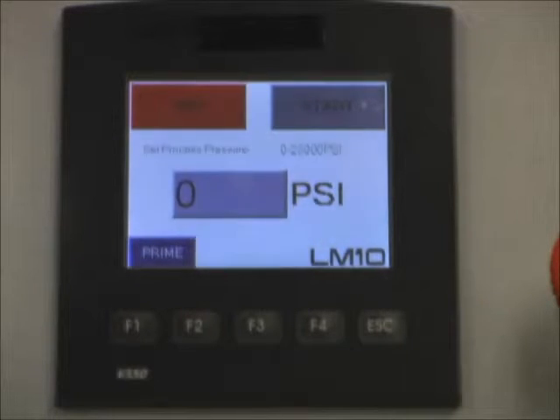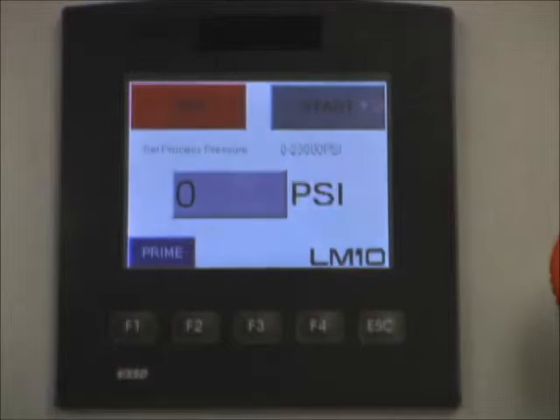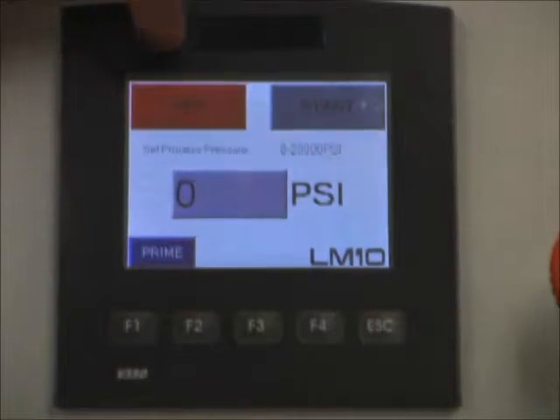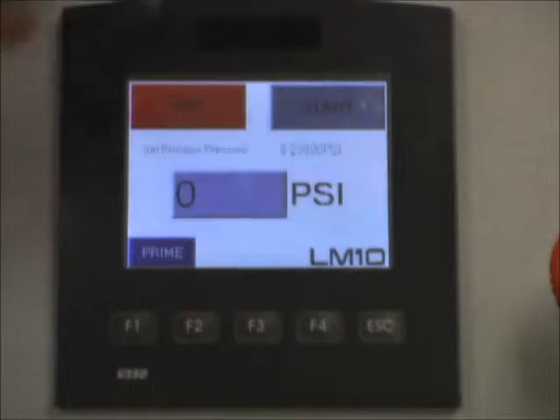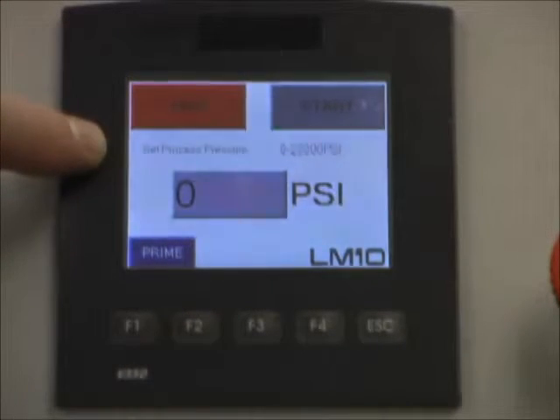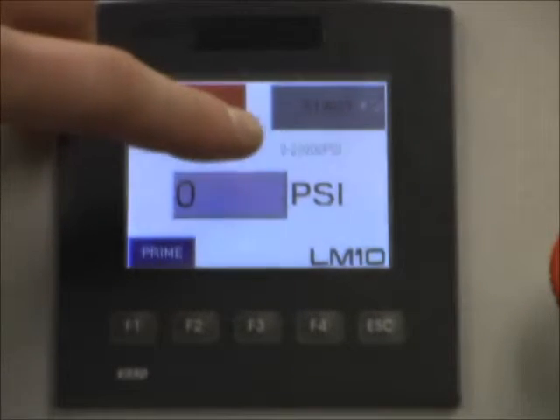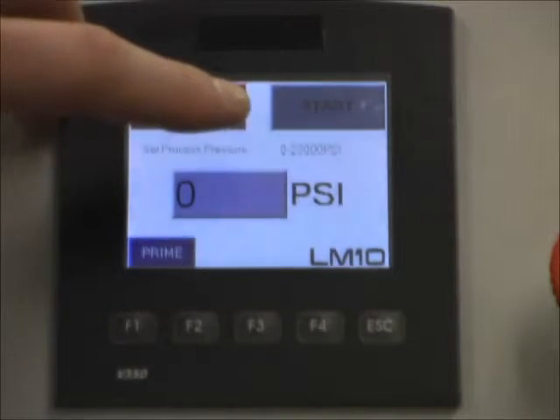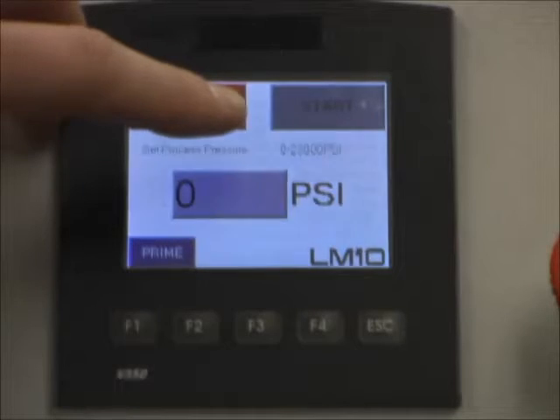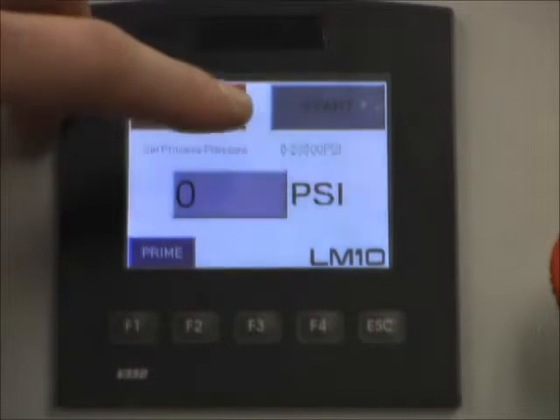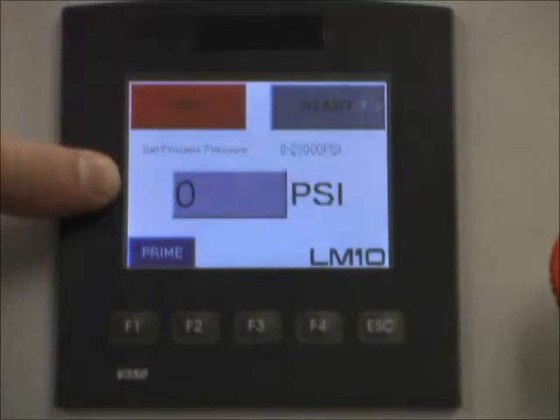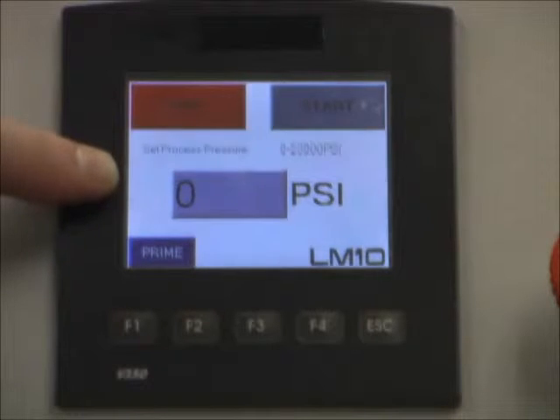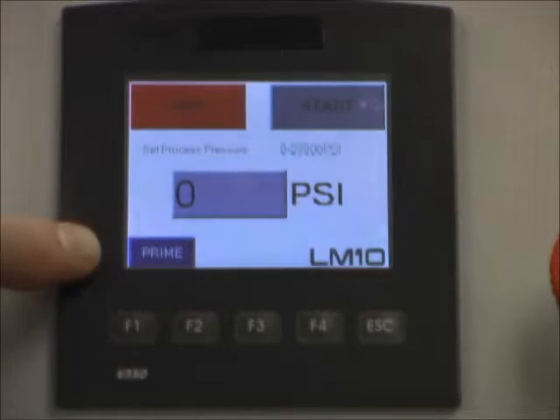This is the F1 screen. At any point we can return to this screen using the F1 key on the bottom. This screen on the top has the on and off controls, a set pressure — depending on the units, this will alert the high and low range for the PSI, bar, or megapascals available. There is also the button to set your process pressure, and a prime button on the lower left.